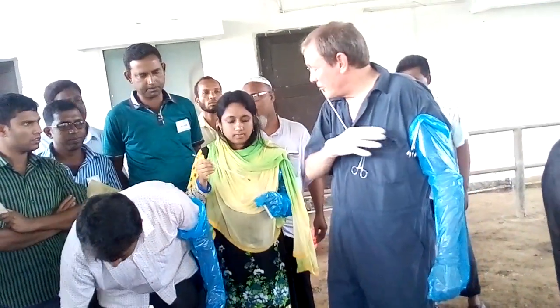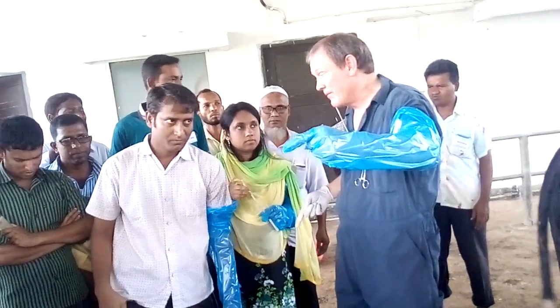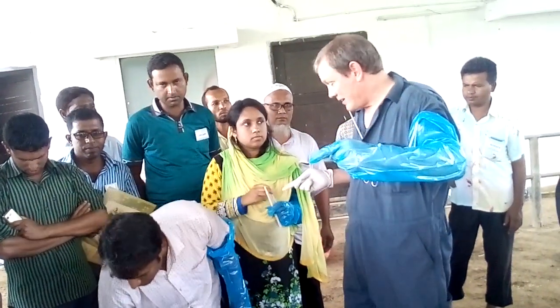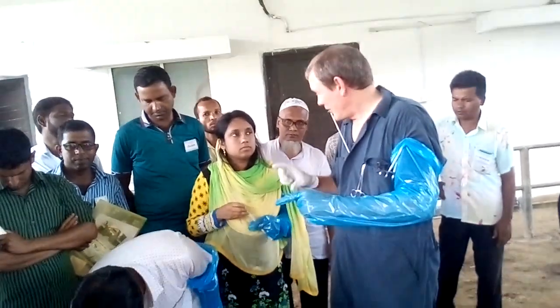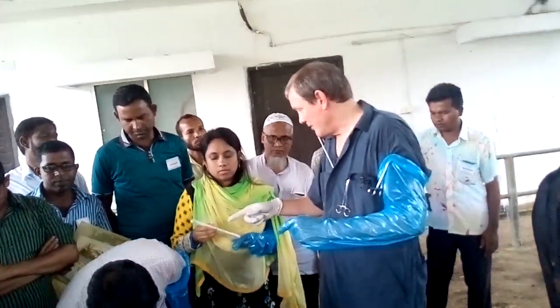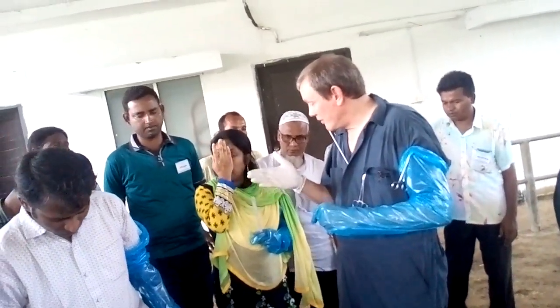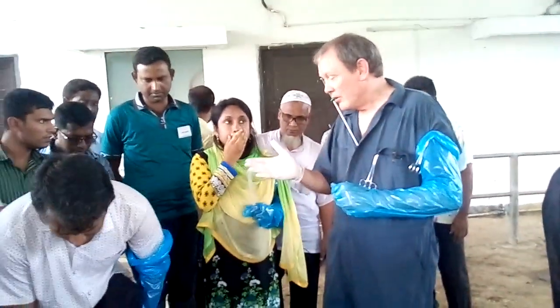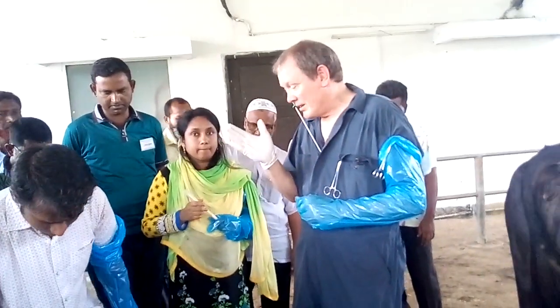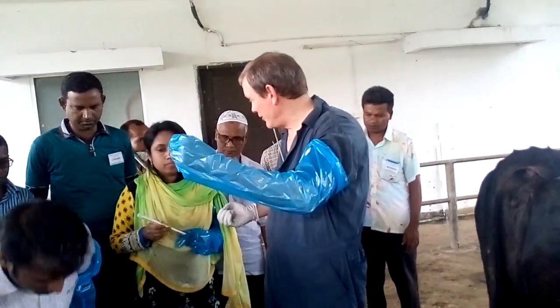My suggestion would be that this thermometer has a very big range of temperatures. If possible, buy a different kind of thermometer where the range is much closer to the thawing temperature. For example, if the range for the thermometer could be from plus 20 to plus 50, that is better than one from 0 to 120.